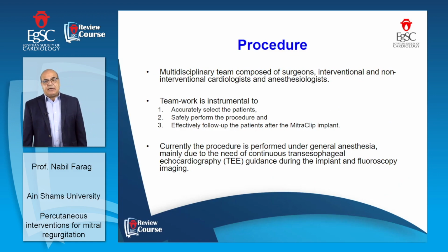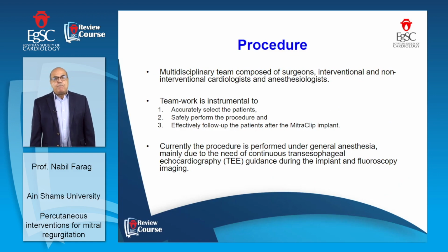For the procedure itself, we have to have a multidisciplinary team. This multidisciplinary team consists of surgeons, interventional and non-interventional cardiologists, and anesthesiologists. What is the importance of this teamwork? The importance of this teamwork, actually, is that it is instrumental.